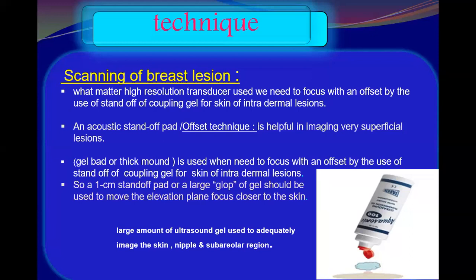For the high frequency transducer, yes, the near zone or the focal or the narrow zone is near toward the skin, but it is not very superficial.